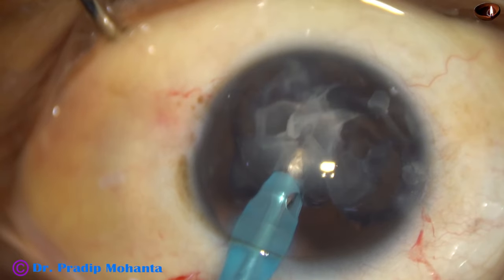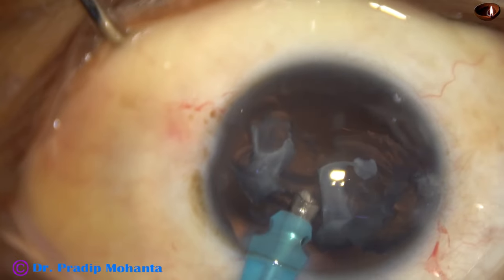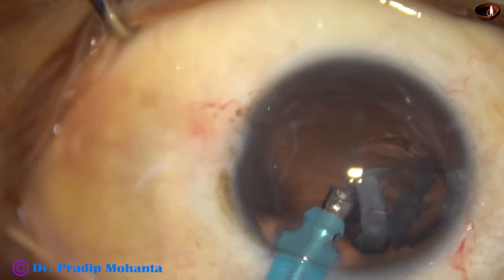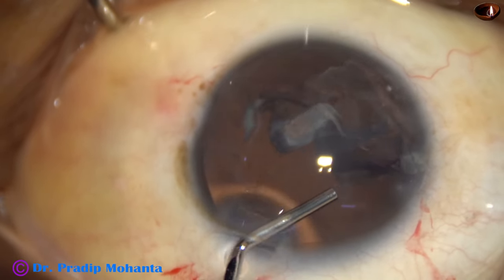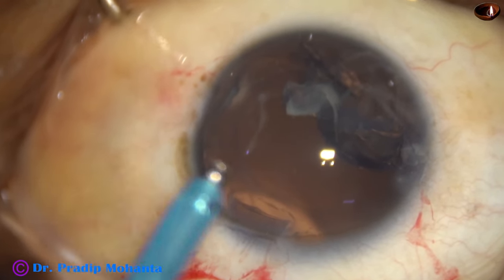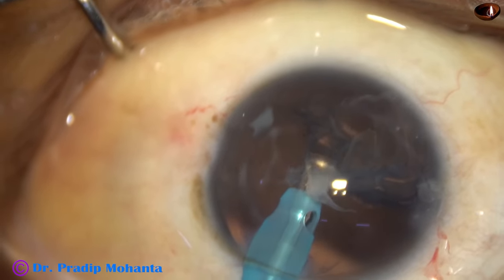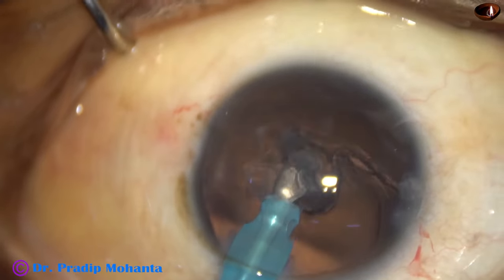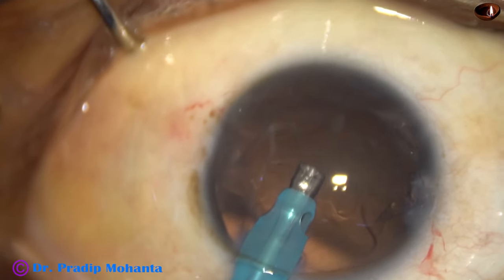This is the last nuclear piece as well as the epinucleus. For the last portion, use visco, push the posterior capsule back, and use the handpiece to emulsify the last piece.